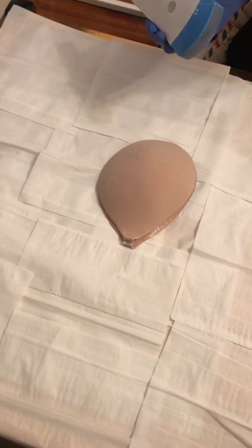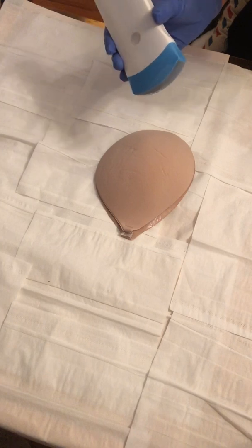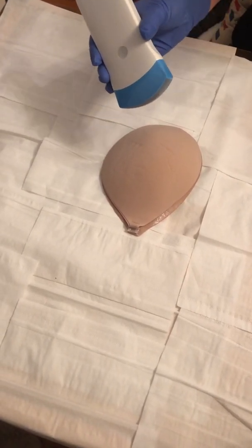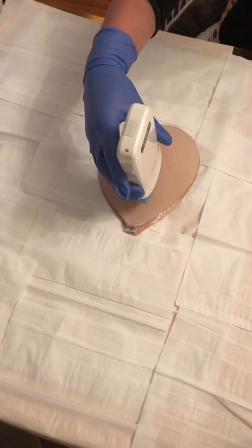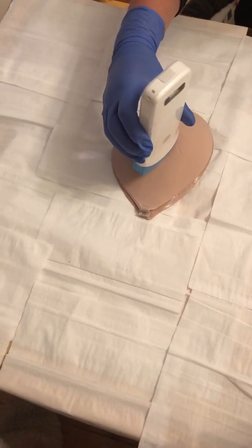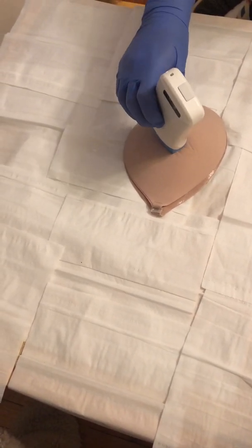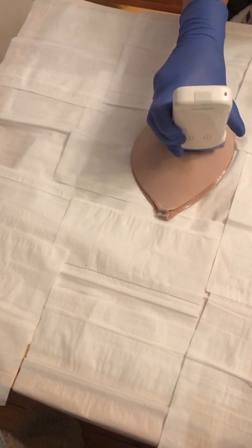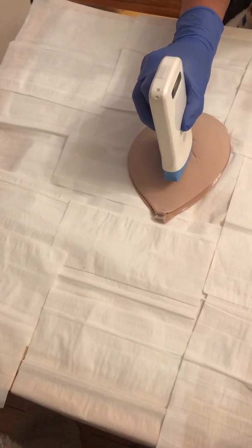So now I'll be demonstrating the radial and anti-radial survey. We will begin the survey in a longitudinal plane with the breast at 12 o'clock. The marker is on the nipple and we'll be rotating in a circular fashion, following that nipple as the pivot point and just rotating around, making sure that the transducer is central to the nipple and back to 12 o'clock.